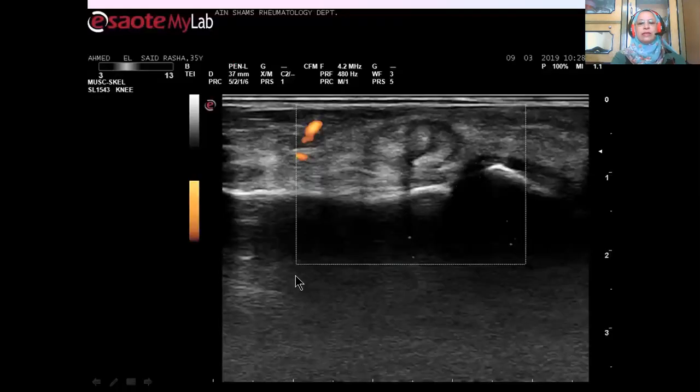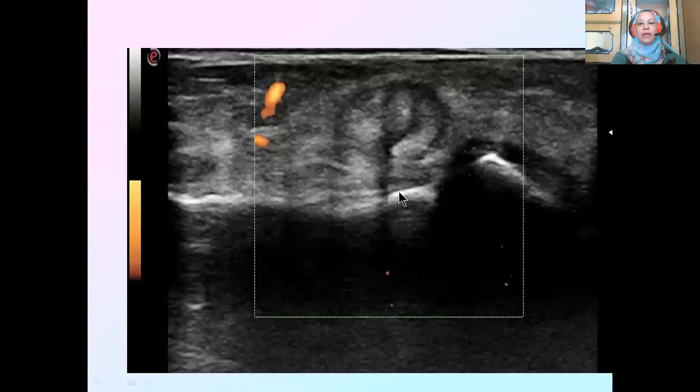Now, what about the lateral ankle ultrasound examination? There was abnormal structure. This abnormality is appearance of 3 parts or 3 pieces of tendon. They appear as if they are 3, but this is due to a split tear in peroneus brevis tendon. This is part of peroneus brevis. This is the second part of peroneus brevis, and through the split tear inside, the peroneus longus tendon herniated. To see magnified image, this is peroneus brevis, again peroneus brevis, and this is peroneus longus tendon herniated through the split longitudinal tear in peroneus brevis.